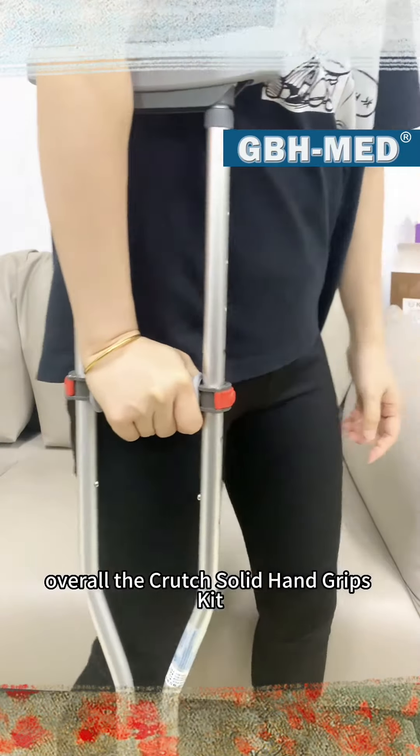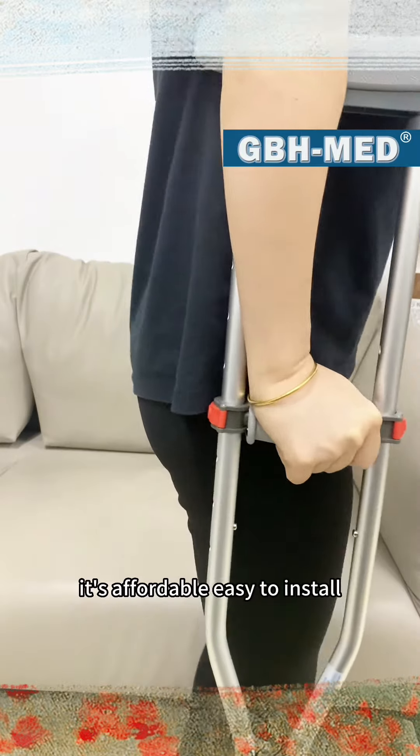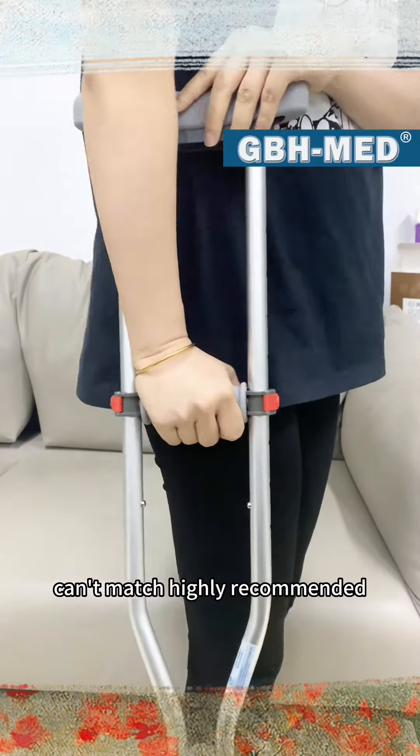Overall, the Crutch Solid Hand Grips Kit is a great investment for anyone who uses crutches. It's affordable, easy to install, and provides a level of comfort that standard hand grips just can't match. Highly recommend it.